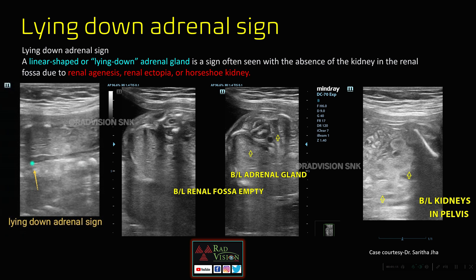Next sign is the lying down adrenal sign. Here you can see the adrenal is normally placed high, above the level of the kidney, but here you can see the lying down adrenal sign, and both the renal fossae are empty. These are the bilateral lying down adrenal signs. This lying down adrenal gland sign is often seen in the absence of a kidney in the renal fossa, and it may be due to renal agenesis, renal ectopia, or horseshoe kidney.